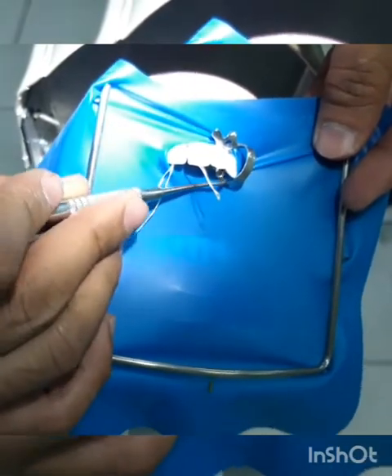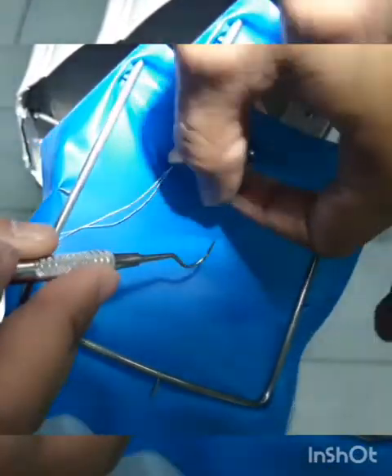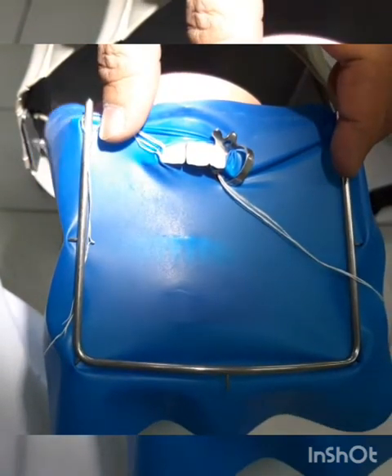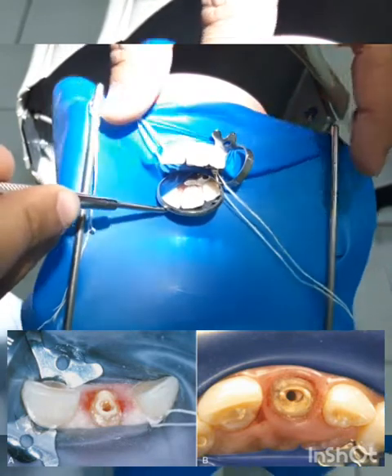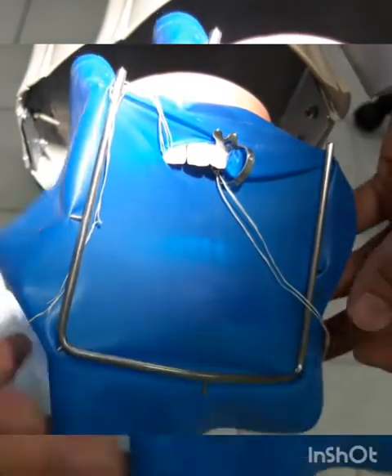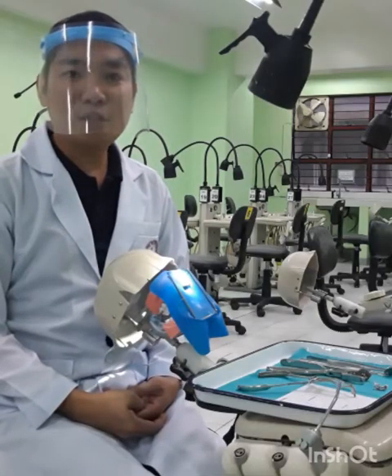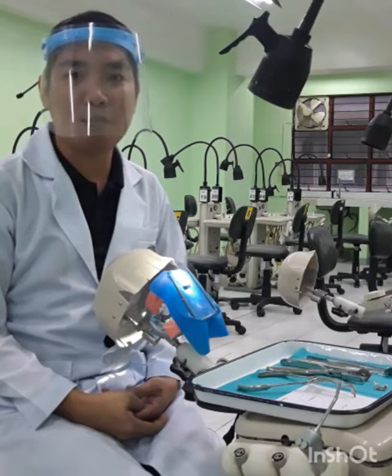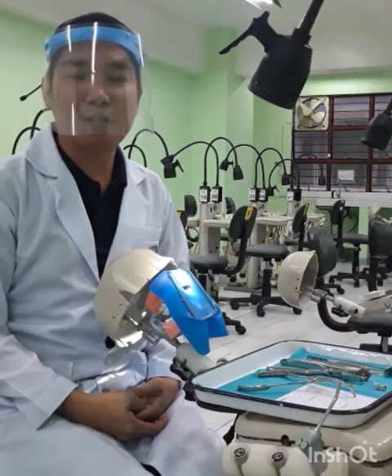That's how you do the split-dam technique, and you are now ready to perform root canal therapy on tooth 21. I hope you have learned something from today's demonstration on the different methods in rubber dam isolation. That concludes our video presentation on rubber dam isolation. I hope you get an idea and are able to perform rubber dam isolation efficiently — this is not only to improve patient safety and protection, but also for a successful treatment outcome.